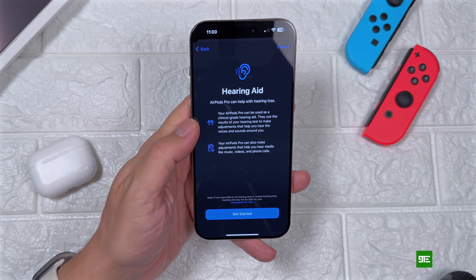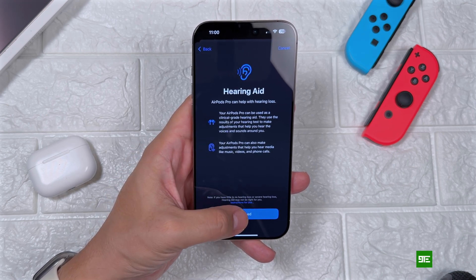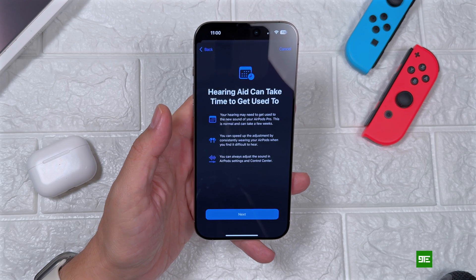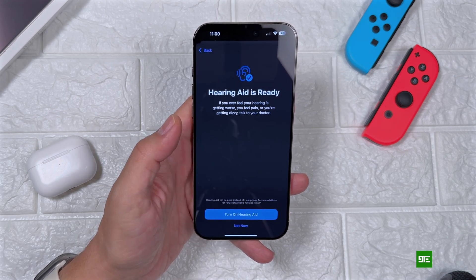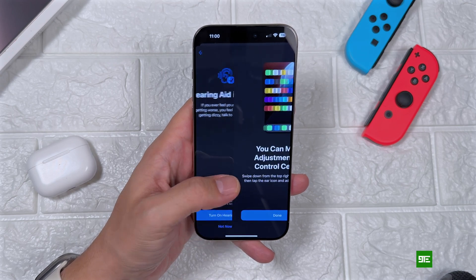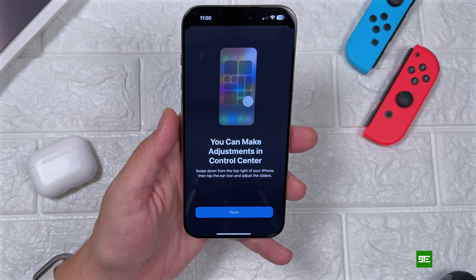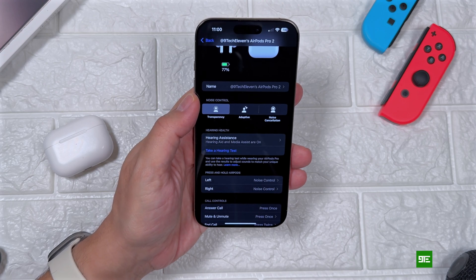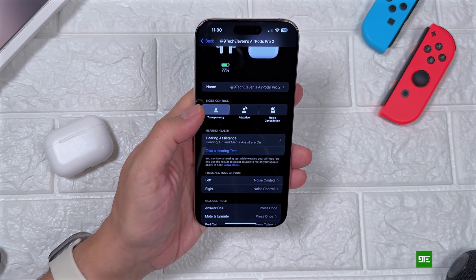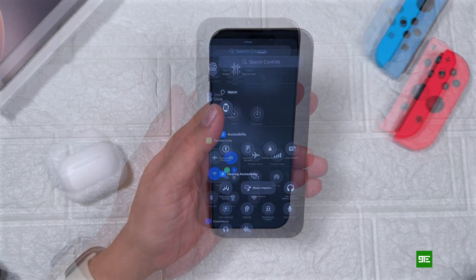You will also be asked once you complete the test if you want to enable hearing aid. Of course, it takes some time to get used to it. It might not be obvious if your hearing is okay, but if you really need support then it's going to be more difficult to get used to at first.